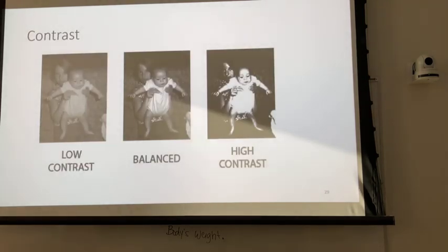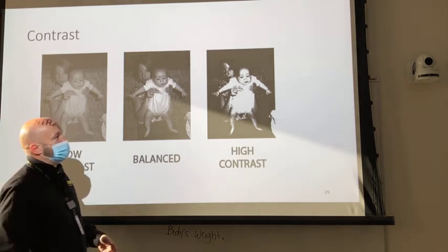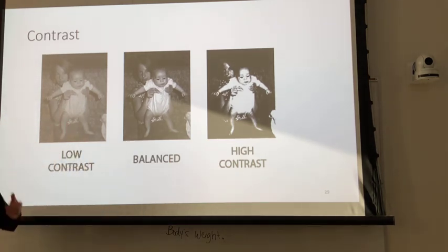So contrast. You're looking at these three images, and in a radiographic image, we tend to look at something that's high contrast and is pleasing to the eye. And that's a radiographic image, because what we think of when we think of X-rays is primarily bone, right?